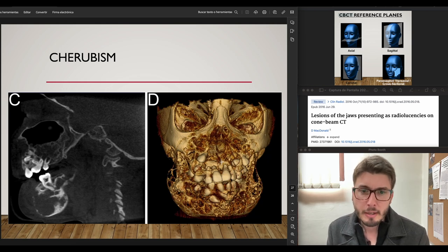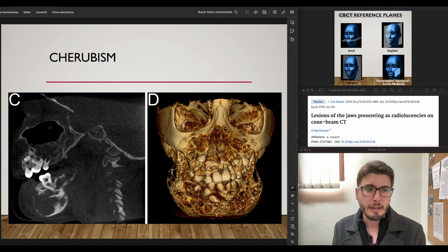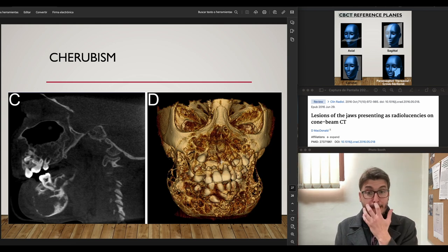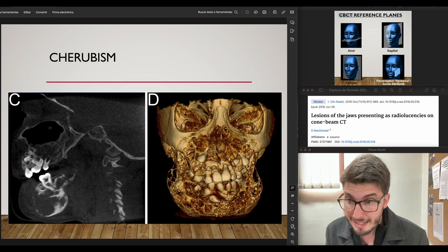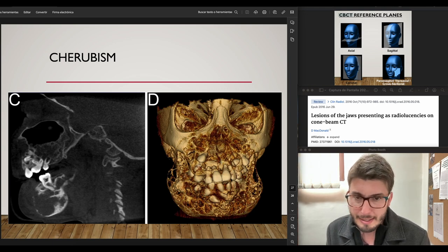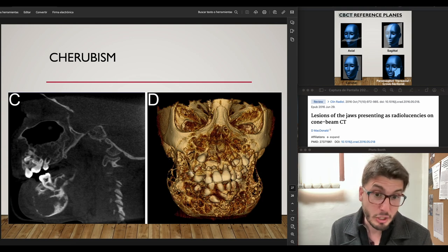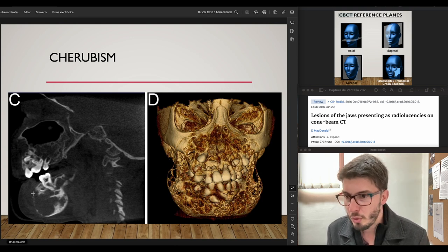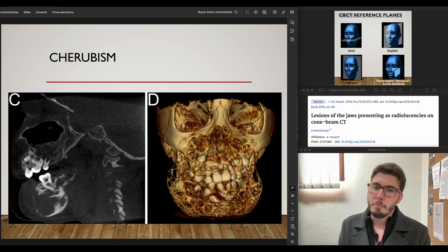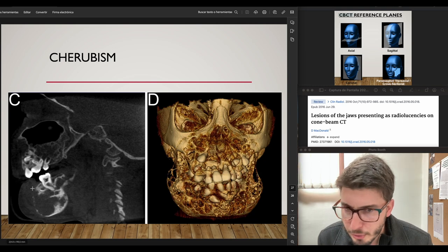Cherubism — patients are very young, and these are bilateral multilocular lesions. They can still be well-diagnosed and surgery can be planned using 3D imaging. There is a lot of buccal-lingual plate expansion, bilateral lesions, impacted teeth, and many other alterations.